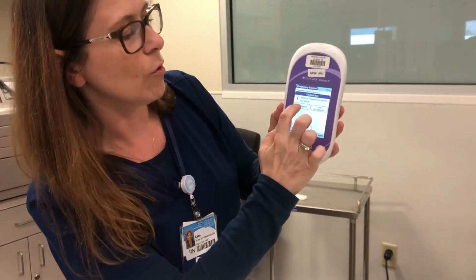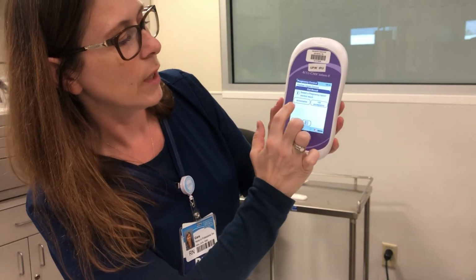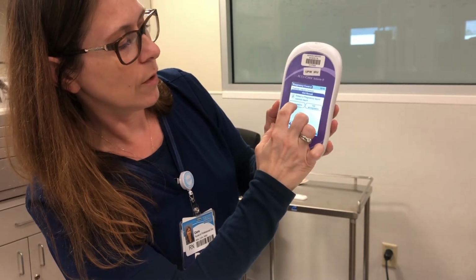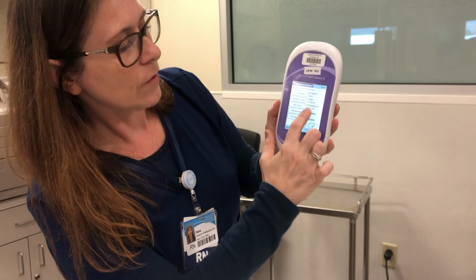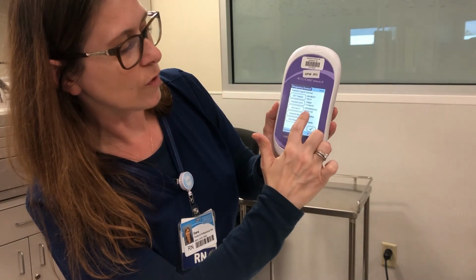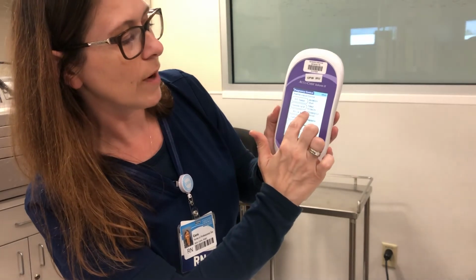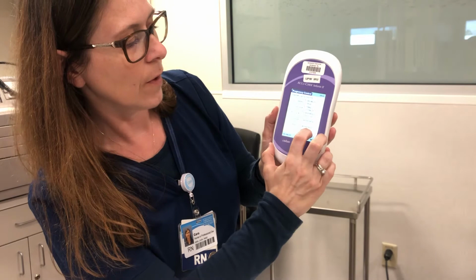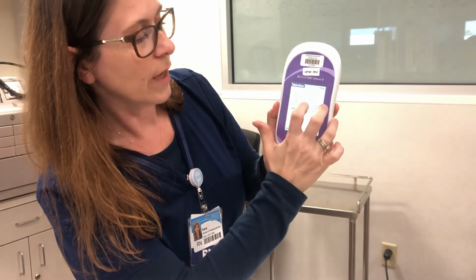Yes, we had control lines on both. It was acceptable. Select the liquid control result. It was acceptable. And so now it's going through, it's telling me everything was correct. My result was correct, my control bar was correct, all my kit, my lot number, everything was right, we're done. And then we're going to enter for the next one.